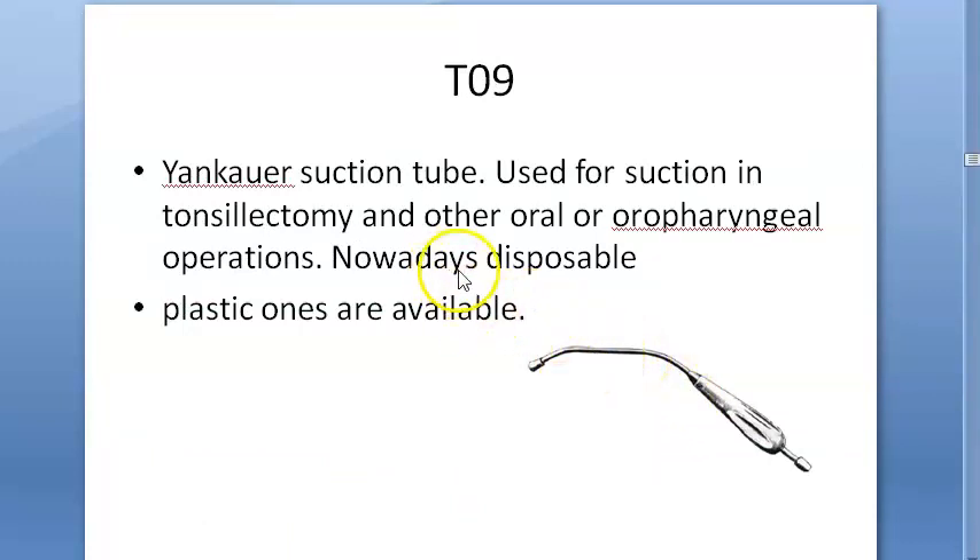Here you have the Yankauer suction tube, used for suction. Nowadays disposable ones are also available. For suction during tonsillectomy, you will use the Yankauer suction tube.